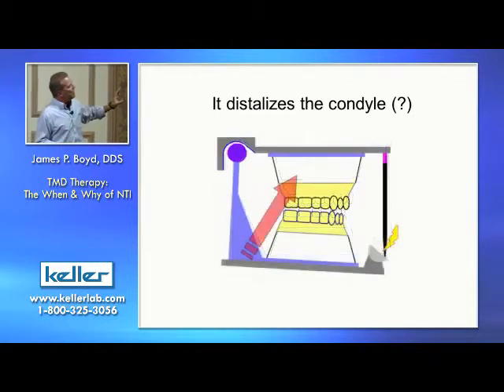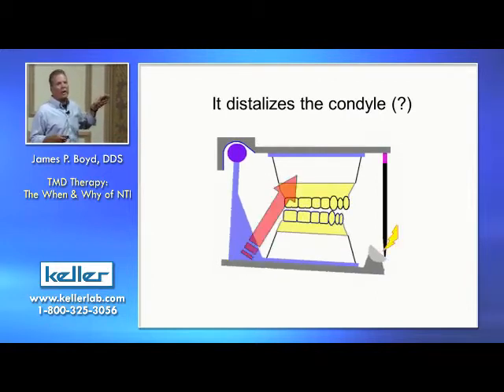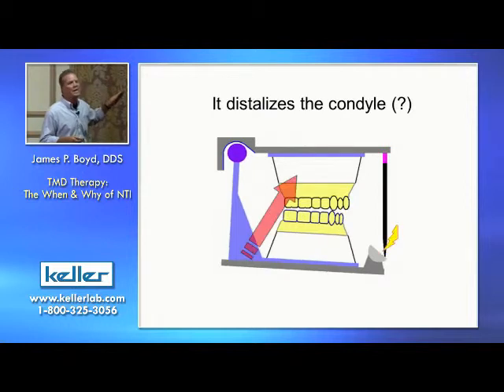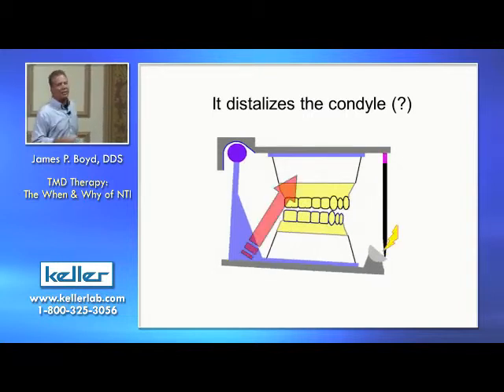If you could just make the articulator the way it's supposed to be, with the maxilla stable, the muscles of elevation only have their unique orientation. Their design is always superior anterior. There isn't any other way for that condyle to go than superior anterior. It doesn't matter what happens out here. The force vectors are always the same.